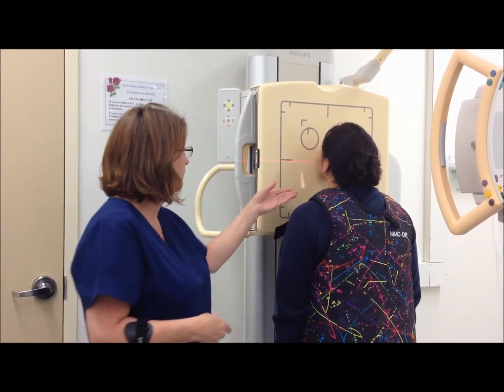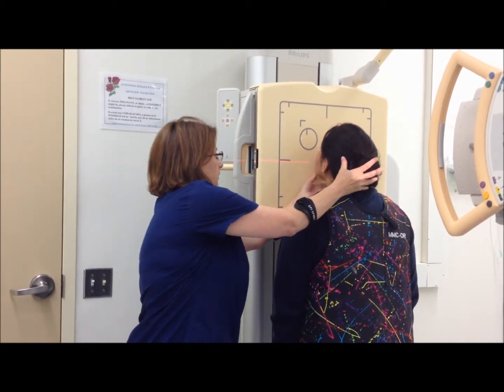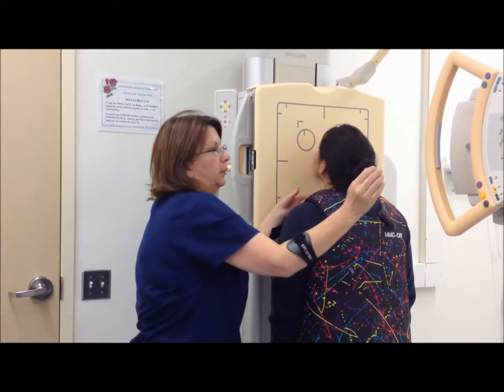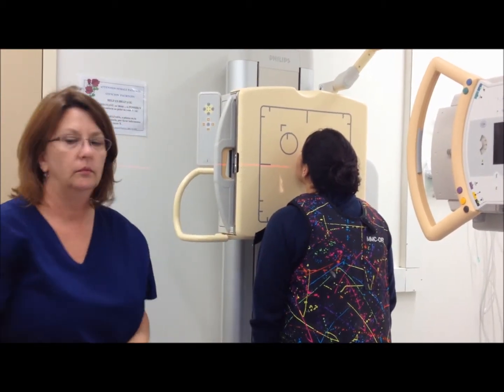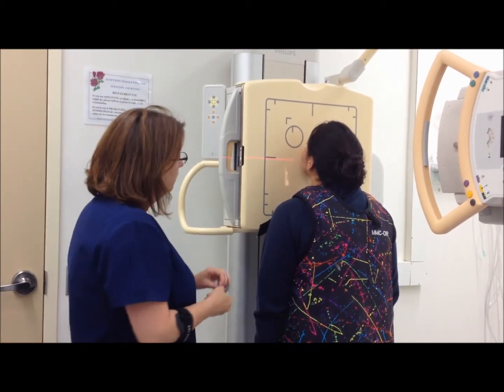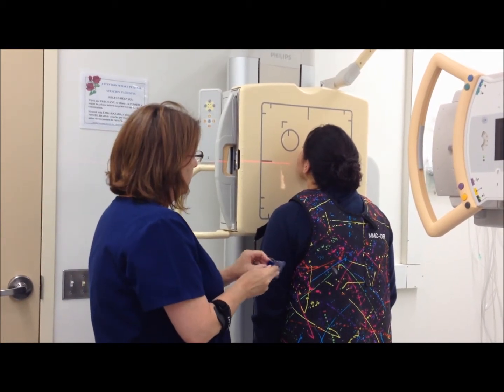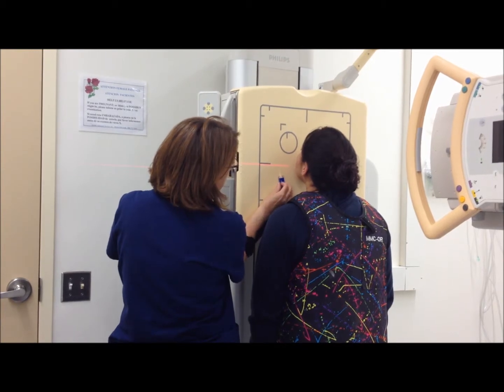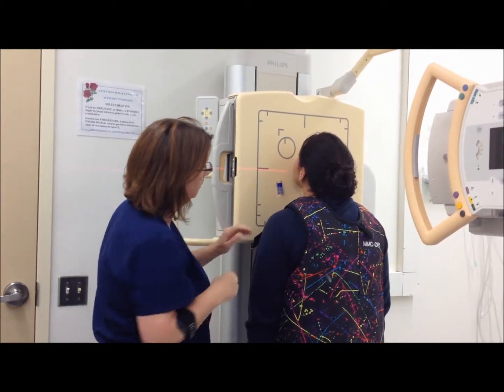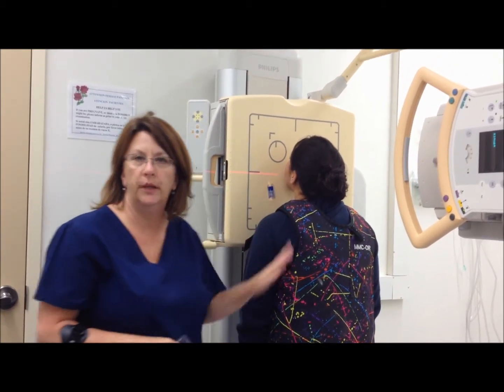Patient is shielded and we are going to put my markers in the light field, but out of the patient shadow.